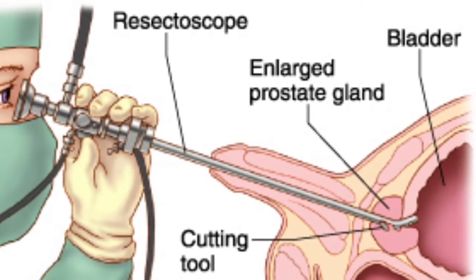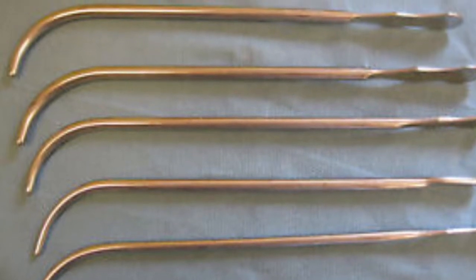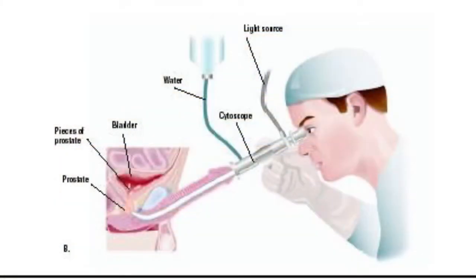The resectoscope is inserted and the resection begins at the middle and lateral lobes and continues in a systematic pattern. Small pieces of tissue that are released into the irrigation fluid will then be evacuated with an Ellik evacuator or a Toomey syringe. As the CST, you must retain all pieces of specimen for the pathologic exam.